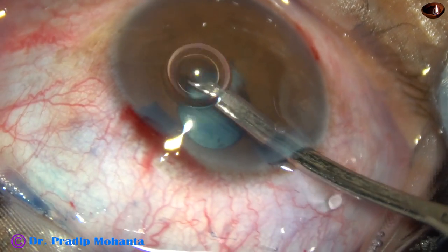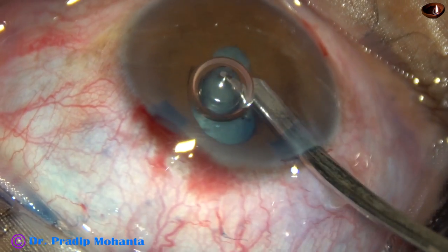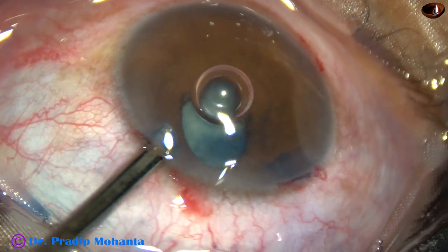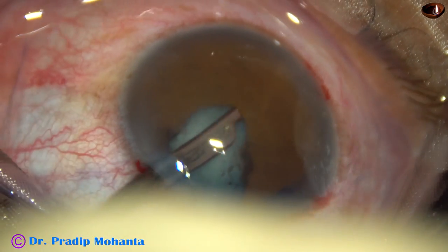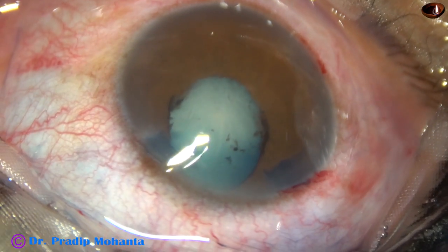With the Simcoe itself I separate the iris from the anterior capsule of the cataractous lens. So the synechiae is broken.